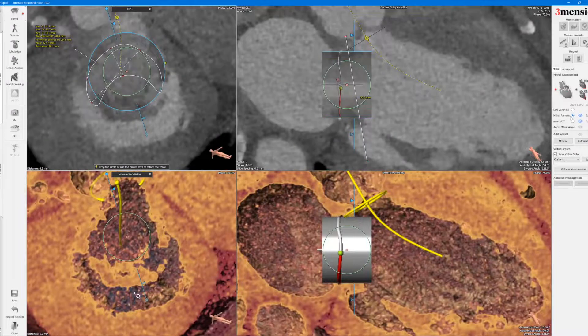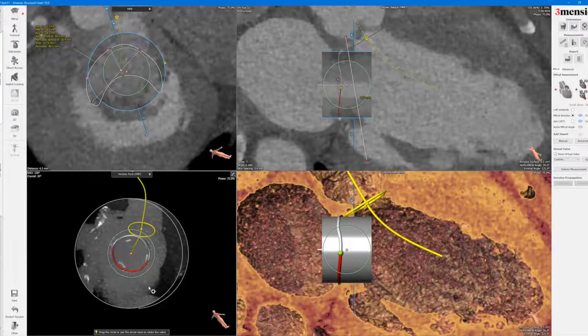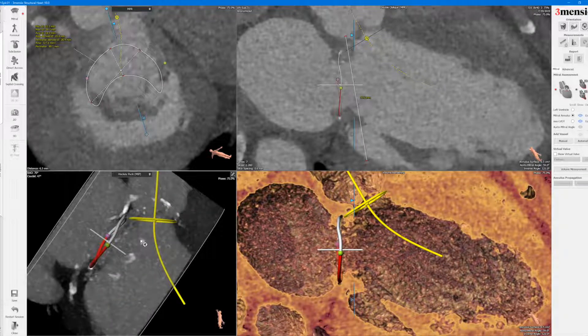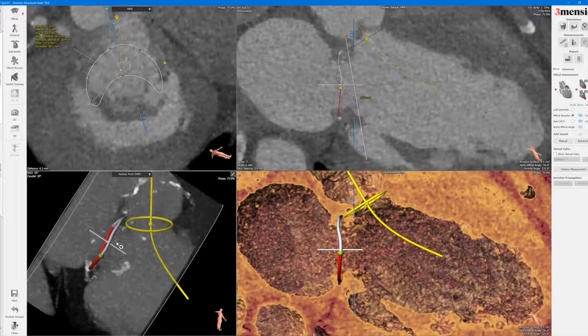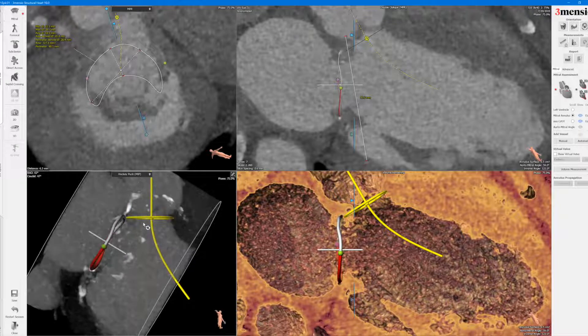Let me go back to the mitral analyst and now go to this hockey puck view, because I'm going to take off the virtual valve to show you how this EPIC will look. You can see there are some fluoroscopic landmarks at the commissure posts and a very faint line at the sewing plane. What you can do is take the parallax out of this line you trace, and then line up the commissure posts to determine the angle.